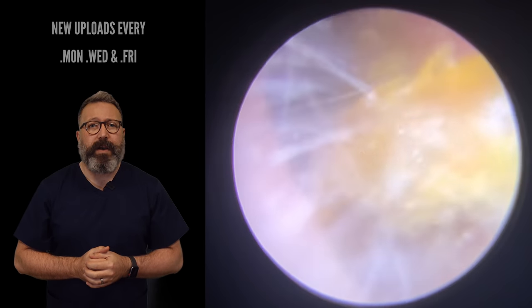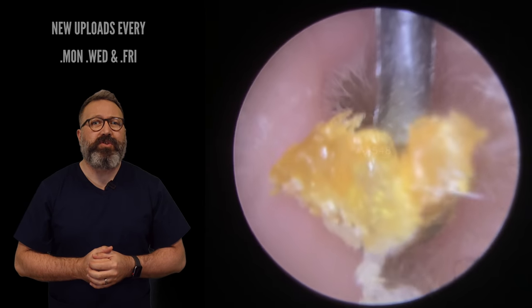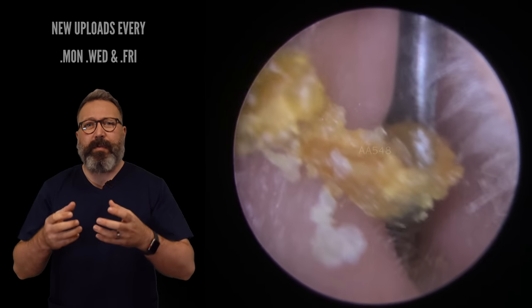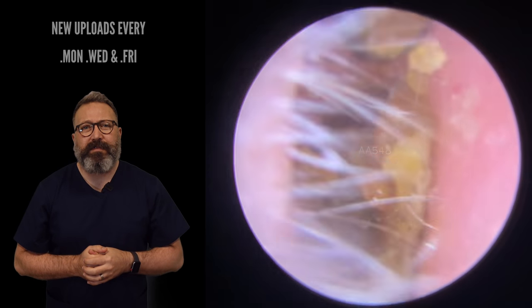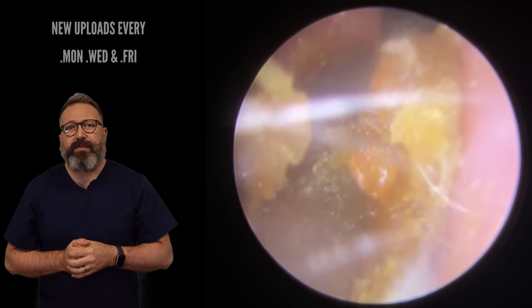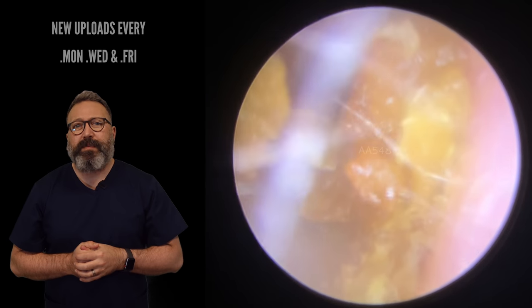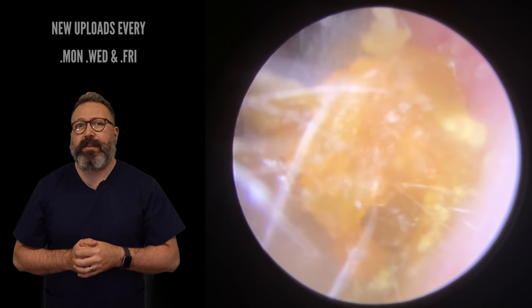It's coming away well, but it's kind of breaking away in installments. It's so dry that it's almost crumbling apart. You can see bits of dry skin hanging off the bottom of that. The patient suffers a lot with dry skin issues. Now, what we may find as we go in a little bit deeper is the wax becomes a little bit softer — it doesn't always happen, but sometimes it does with these plugs.